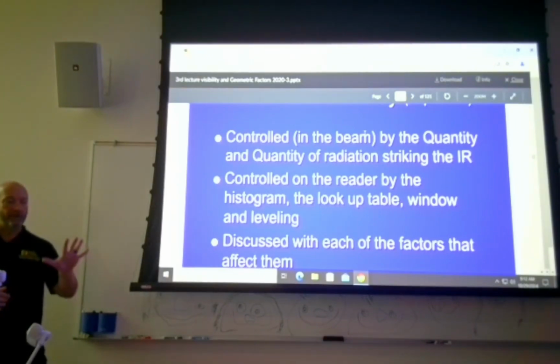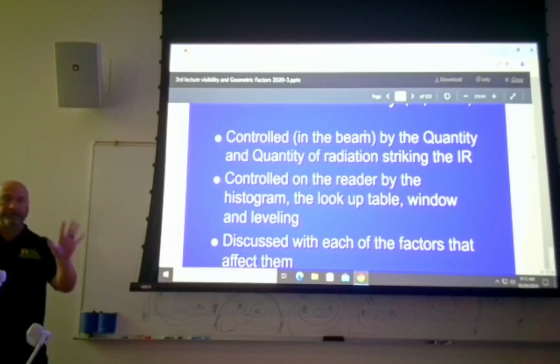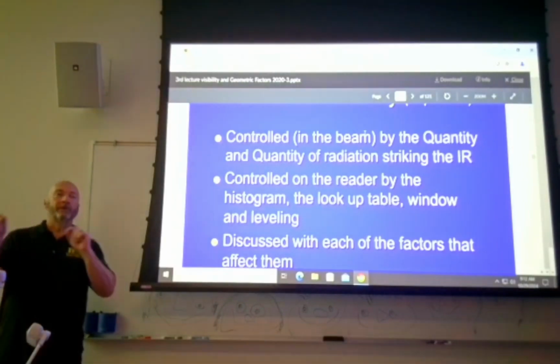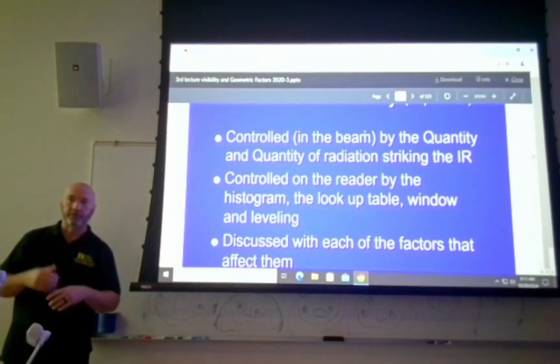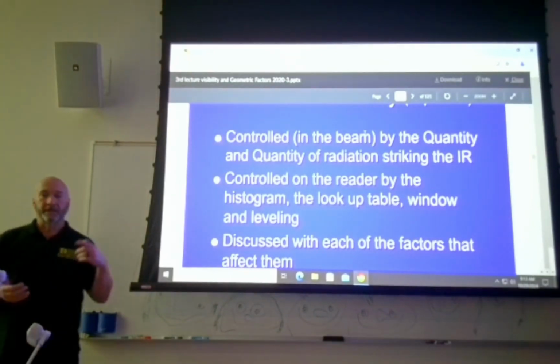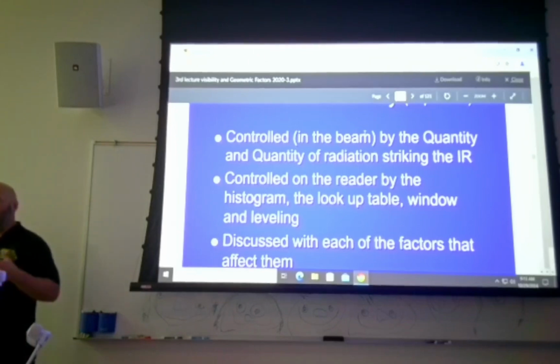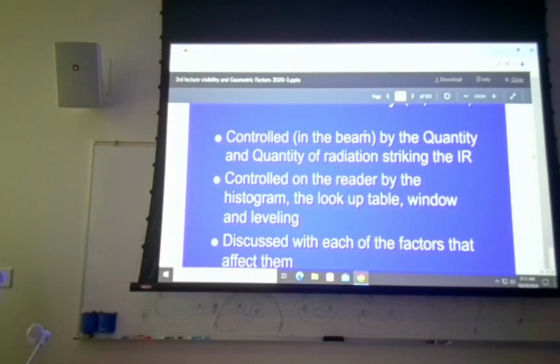All right, so let's say we shoot a hand on an image receptor size that's the full size of your image receptor. The collimated field is the full size of your image receptor. What your computer is going to try to do is, it's going to take measurements all the way across that image receptor. So what it's getting is a lot of direct exposure to the image receptor. So it reads that direct exposure as overexposure. So even if you use a perfect technique, since you got all that area that's so dark, it's going to read that as overexposure, and your index number is going to be off the charts, overexposed, right? So applying the computer algorithm to that might have some effect on your overall contrast. Certainly the overall density, but the contrast in the hand itself may have some issues there as well.